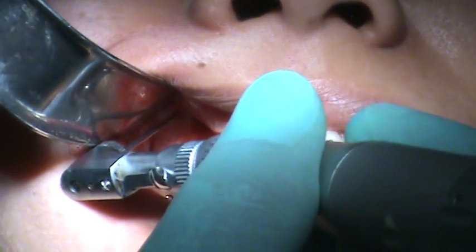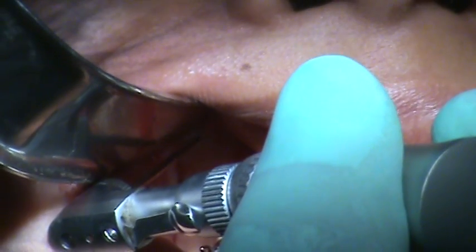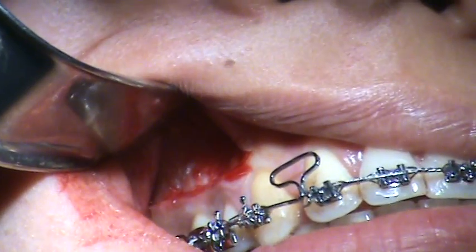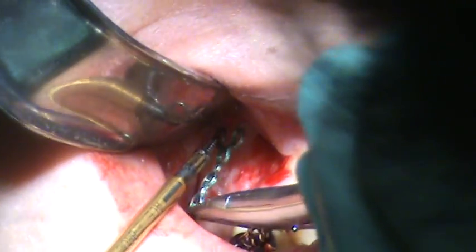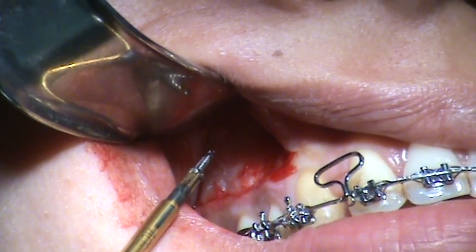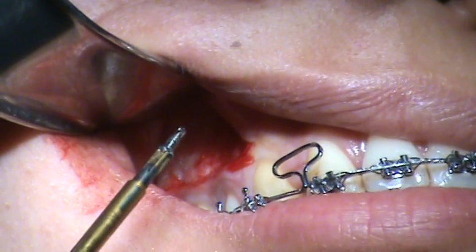The pilot hole is being used. The pilot hole is drilled for two reasons: to ease the placement of the bone screw and also to check the quality of the bone. The thicker the bone, the better the quality. The goal is to ideally get a double cortical plate.